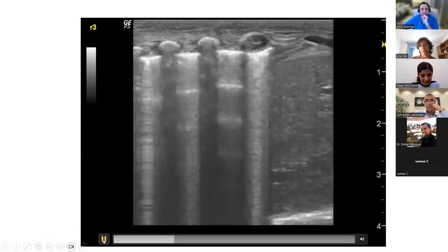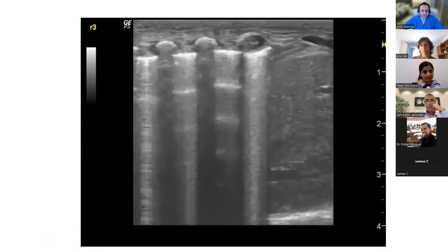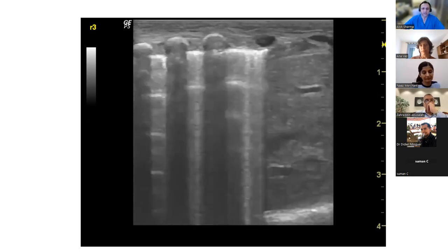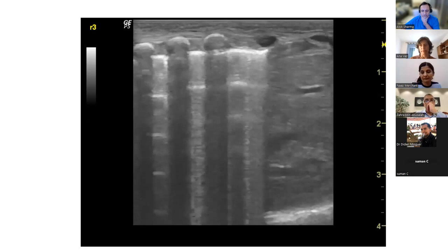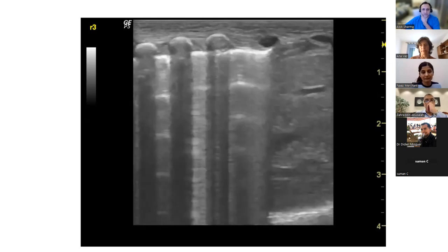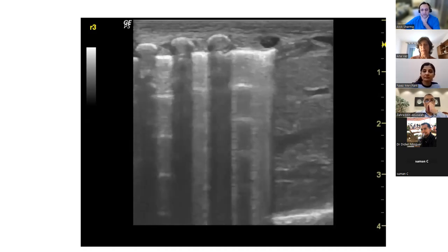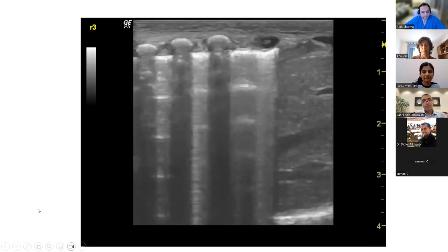The probe is parallel. The challenge of coming to R3, as usual, is that you're in the top half of the axilla, so often the pleural line does appear a little bit blurred because getting that alignment with the probe can be a little bit difficult. But again, you've got some compact B lines coming in and out with respiration. I think in a transitioning lung, and this is the point that Dr. Liu makes about the transition of transient tachypnea, the upper lung fields tend to get aerated more quickly as compared to the lower lung fields. So you tend to see double lung points generally in the resolution phase. Very good image.